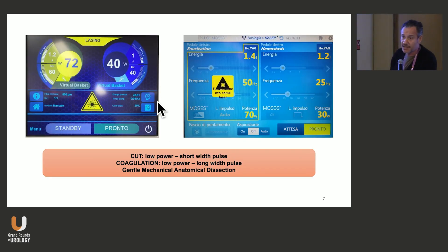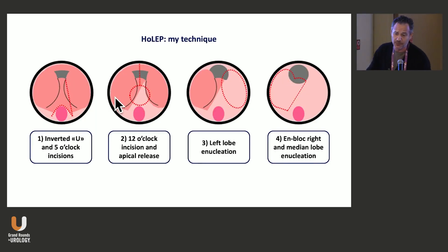These are the settings I basically use, depending on which laser I have that day, since I operate in two different rooms. I like to cut with low power and short pulse, coagulating with low power and long pulse. And I use just a gentle mechanical anatomical dissection — something different from what you may have seen. I will show you in the video why, because if I just do a gentle dissection, I can clearly see the plane and I'm not going to get lost.